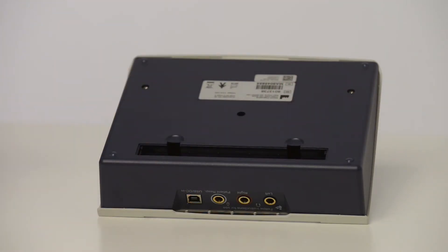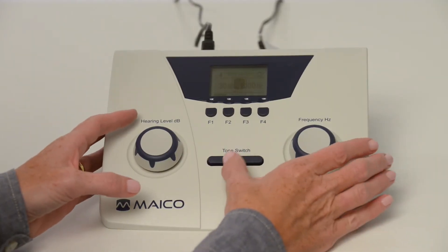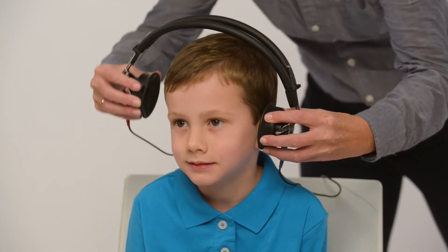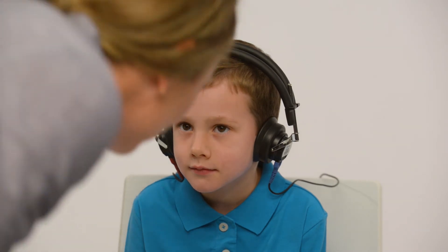The MA25 has the option to be operated by batteries. Power on the device by pressing the tone switch button. Place headphones directly over the child's ears with the red phone on the right ear, blue on the left. Remove any obstructions that may interfere or be uncomfortable, such as glasses. Adjust the headband so the headphones are centered over the ear canal.